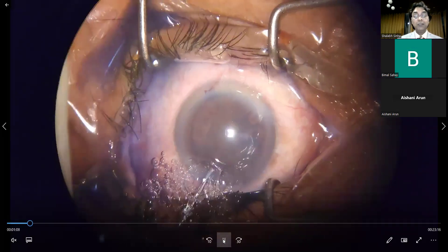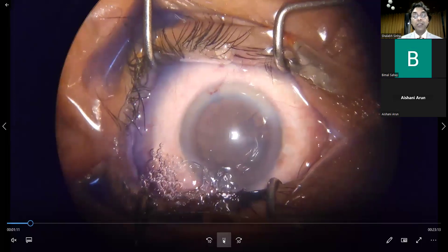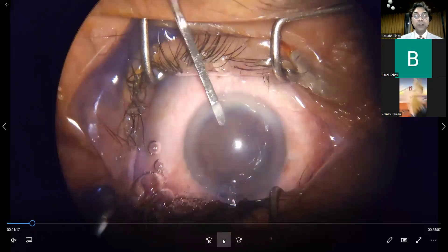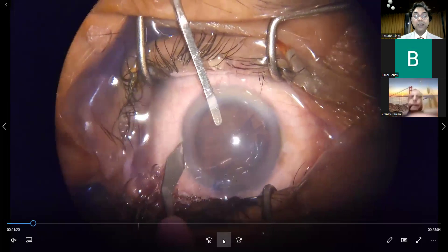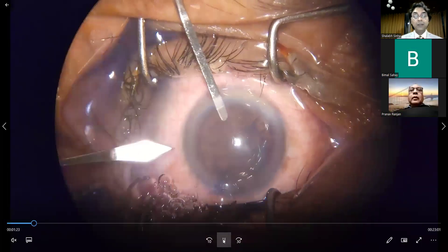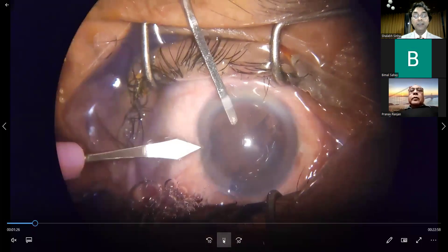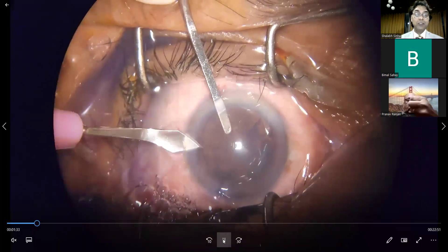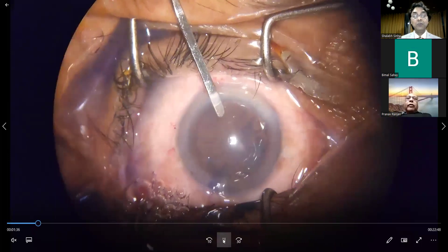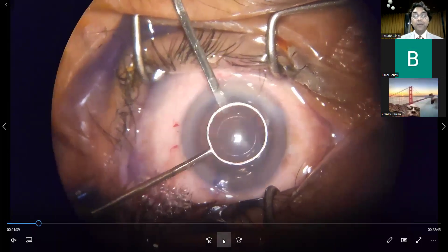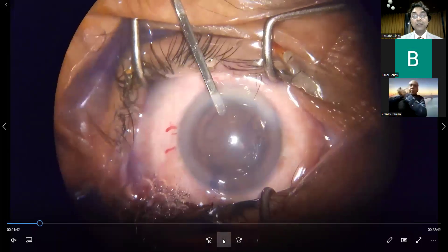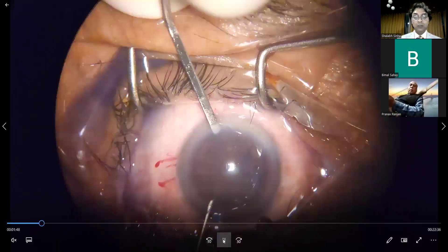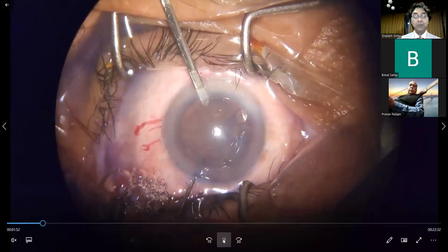Once the trypan blue has been washed, HPMC viscoelastic is injected into the anterior chamber. Using a spatula to stabilize the eye, the 2.2 keratome is used to fashion the incision, which is slightly enlarged to 2.4. This is the Gaurav Luthra's capsular axis marker — it's always a good idea to use a marker to know exactly how big your capsular opening is going to be.